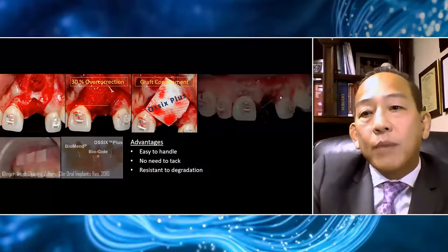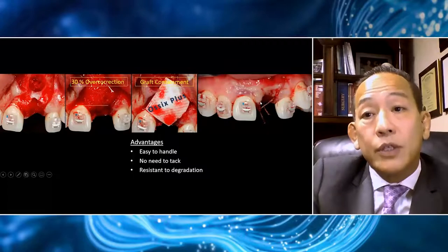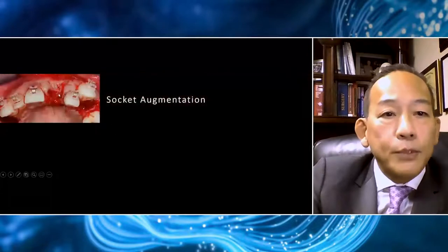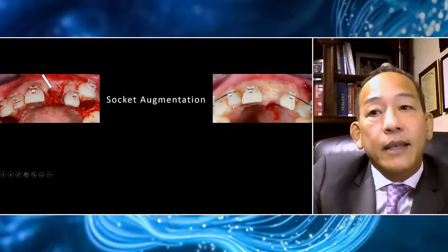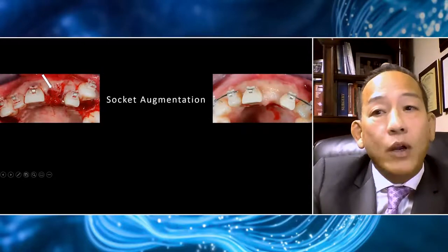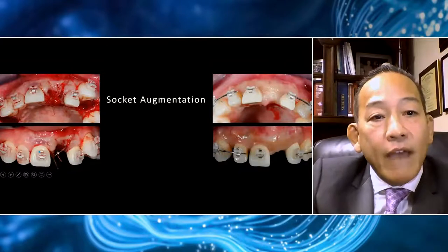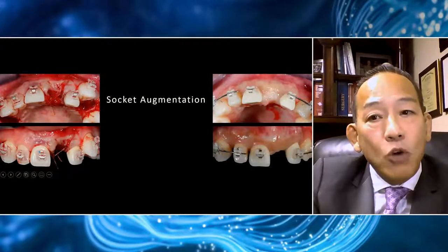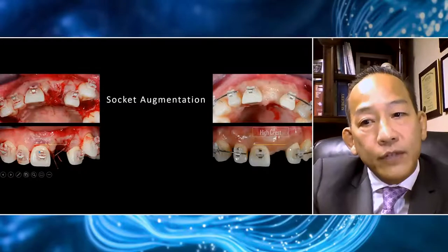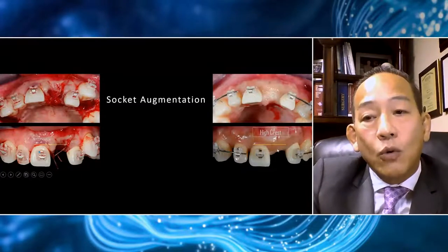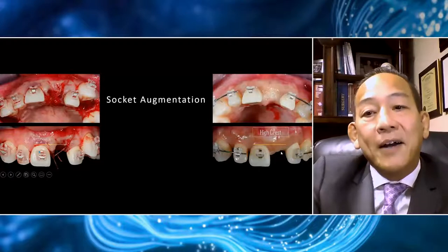This is important because I'm going to purposely leave a small area of the membrane exposed to encourage tissue to form into that area. We purposely leave this area exposed, and because it's surrounded by keratinocytes, we are purposely leaving it exposed to gain more keratinocytes — in other words, to gain more keratinized tissue. Because we can contain our graft without it migrating apically, and we leave the membrane exposed over the graft, over time we now have a high crest. From four months later, the tissue has granulated and we have more soft tissue, more keratinized tissue, more vertical tissue to work with.